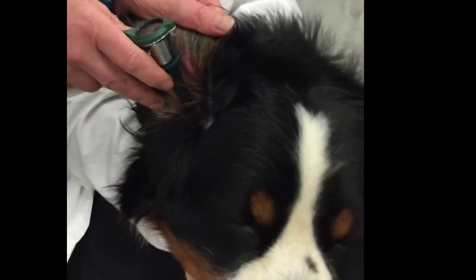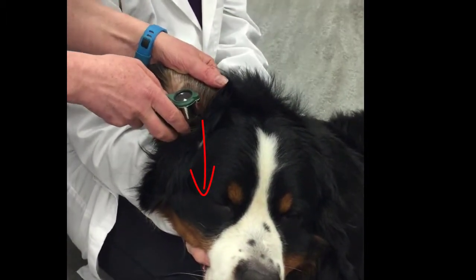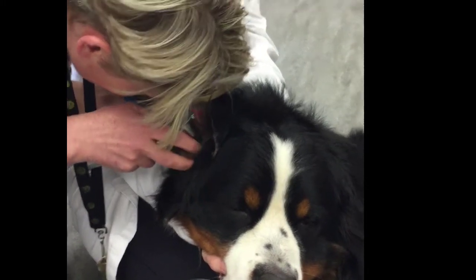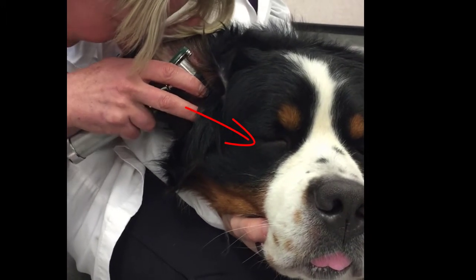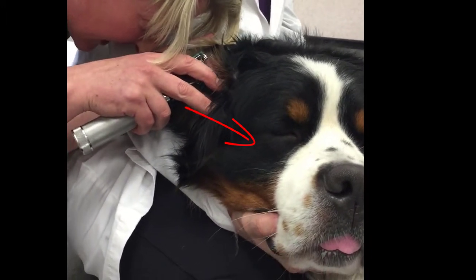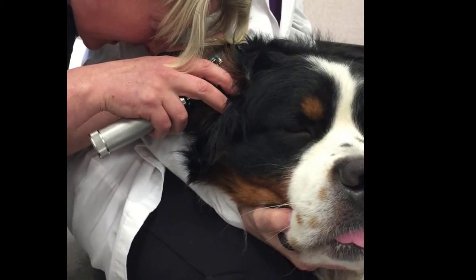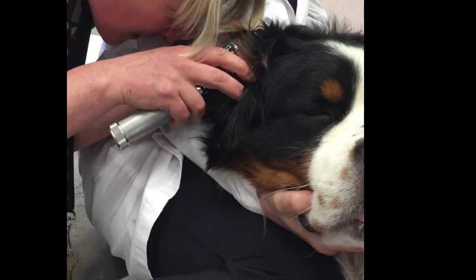So I'm going to go vertically down, and I'm going to look through as I go in, and then I'm going to rotate, pulling the ear flap. See how I'm holding in my left hand the ear flap? And I'm going to rotate so I can see all the way to the eardrum. And the eardrum is kind of a translucent, whitish membrane.